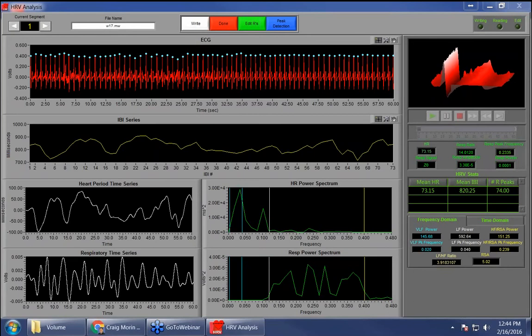And so all of these data are exported along with your physio to the Excel file, which we'll view in a little bit. But this is sort of just explaining where it all comes from. And then obviously we have our very low, low, and high frequency, which is basically represented here between these two bars. So very low, low, and then your high frequency.